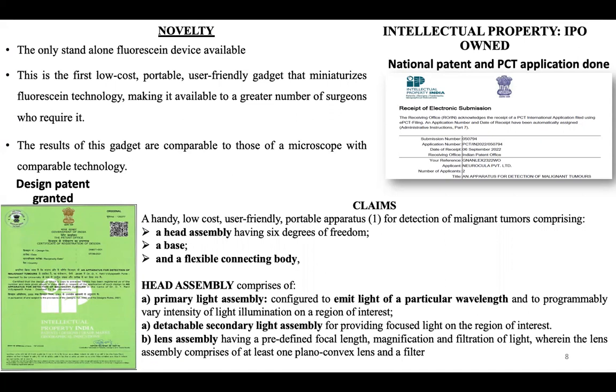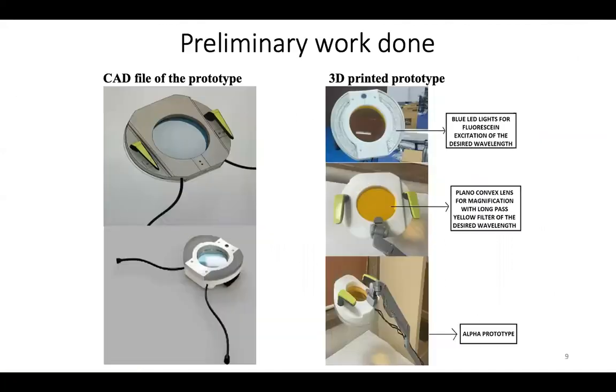We have been granted the design patent of the application, and a national patent and a PCT application has also been done for the device. The claims of the patent applications have been highlighted in this slide.